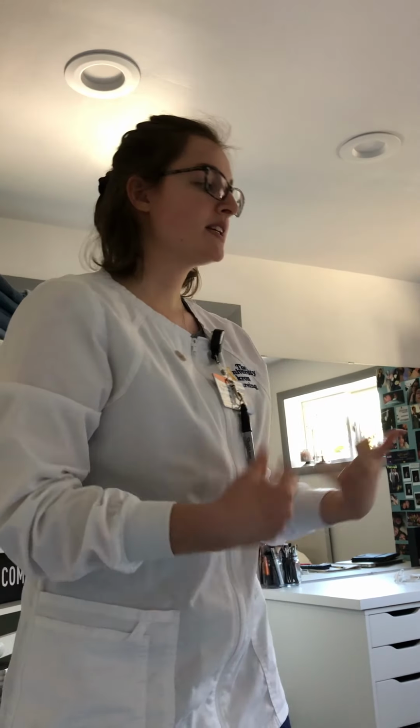Okay. So after I did that, I would just explain to the patient that I'm going to be performing a urinary catheterization. She'd be getting a Foley cath today per the physician's orders. I would then make sure that was okay, and I would assist her into a comfortable position. She needed an extra pillow, whatever is more comfortable for her.